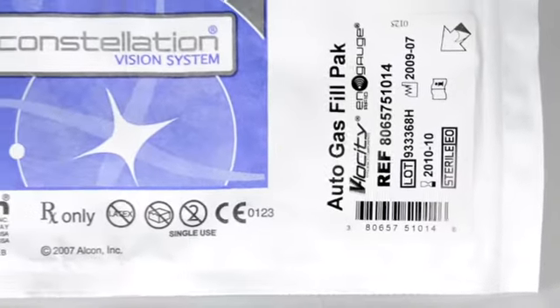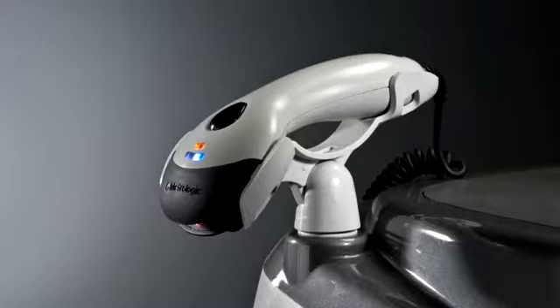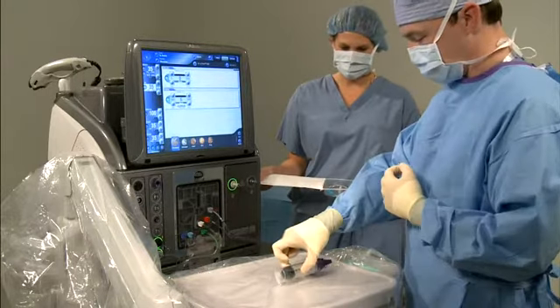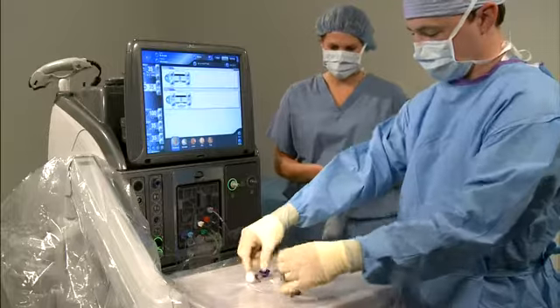Each Alcon product pack has a barcode located on the labeling. Before opening an auto gas fill pack, scan the barcode on the barcode scanner. After scanning, peel the lid from the pack and aseptically transfer the components to the sterile field.